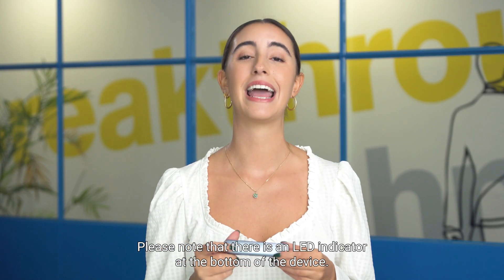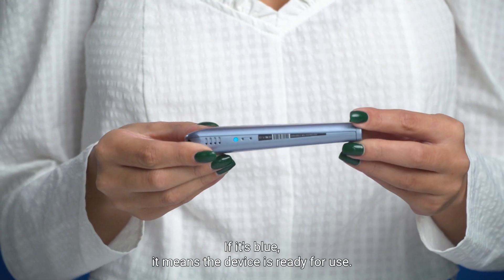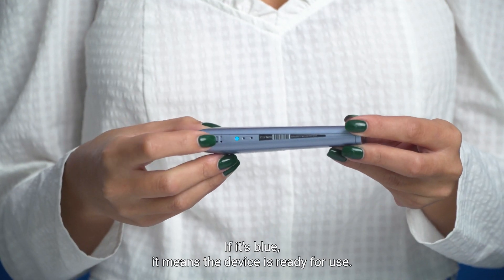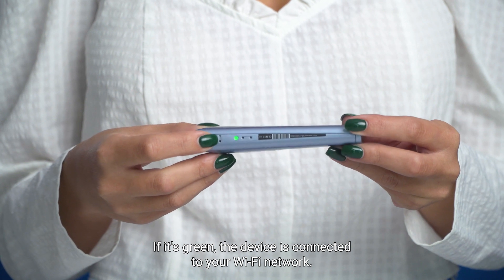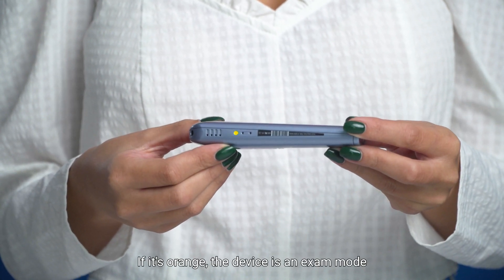Please note that there is an LED indicator at the bottom of the device. If it's blue, it means the device is ready for use. If it's green, the device is connected to your wi-fi network. If it's orange, the device is in exam mode.